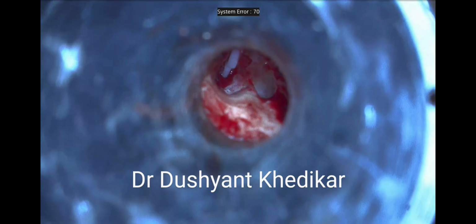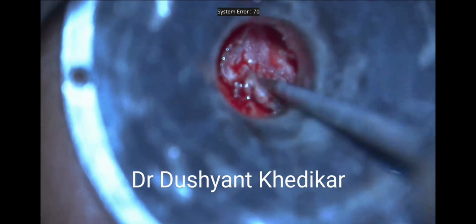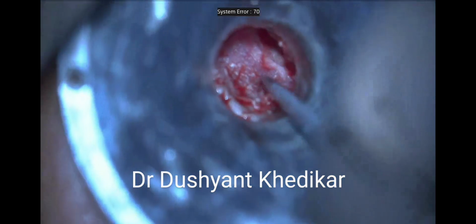Once the piston position and crimping is confirmed, the tympanomeatal flap is repositioned to the canal wall and subjective improvement in the hearing is tested. This ends the surgical demonstration.